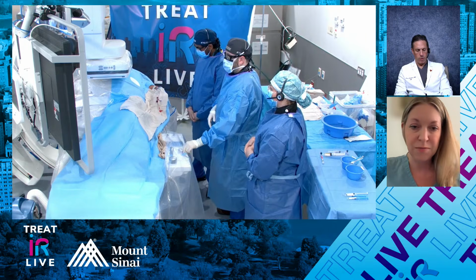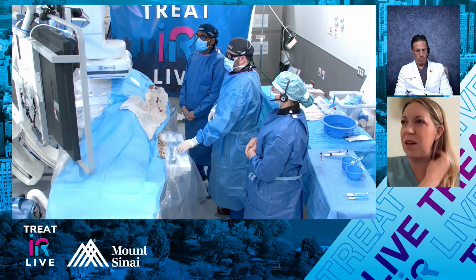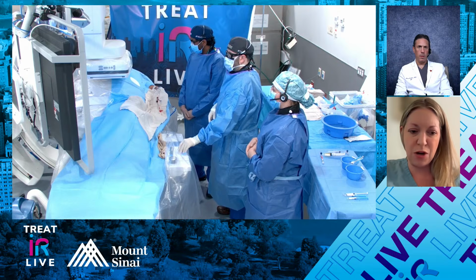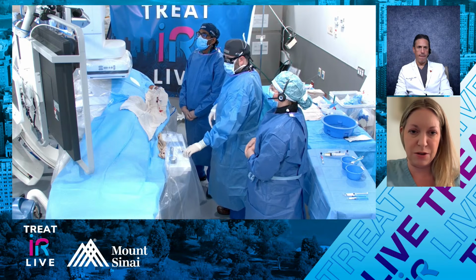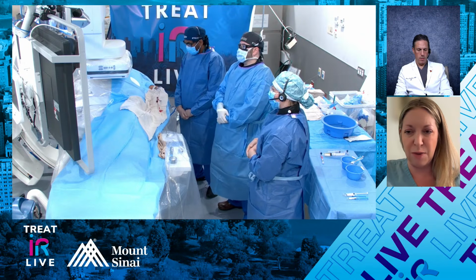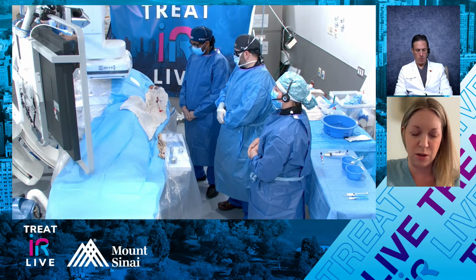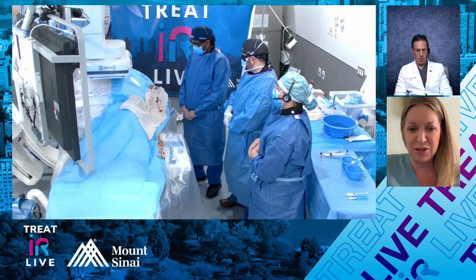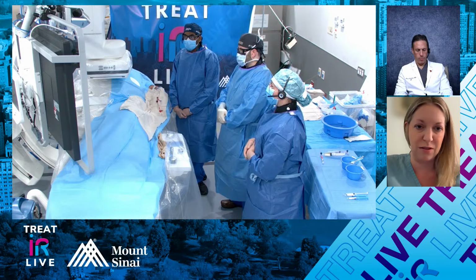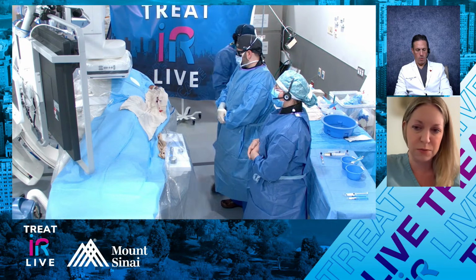And when you do radial, is there a specific catheter that you like to use? I've been using a 110 TIG, something in the 110 range. But you could use, like, Jay's using a 120. It depends on the microcatheter. You might need a longer microcatheter to reach distally, to get more selective. I like to use the 2.4, but if you're using a 2.0, then you could use a 165 length and make up for the length that way without having to go in too far with your parent catheter.